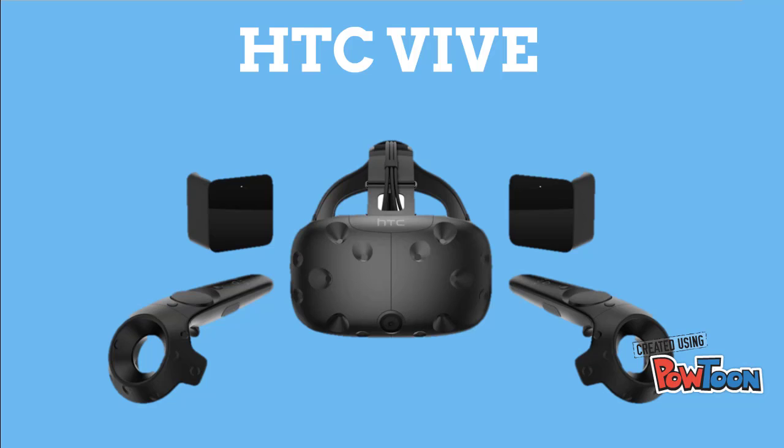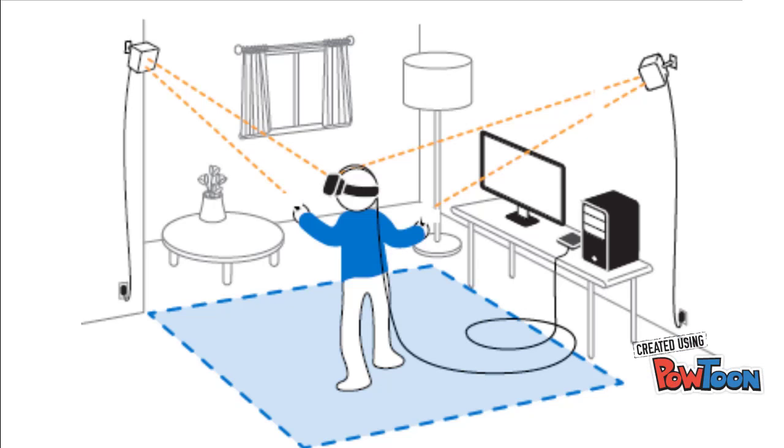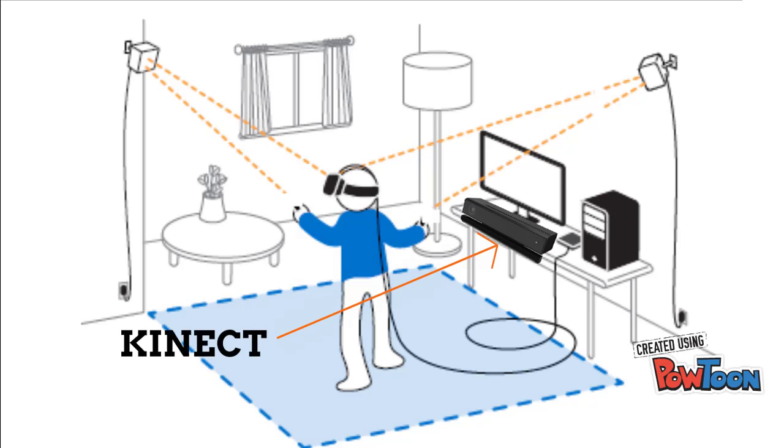especially with its controllers. However, in this system, we will use HTC without controllers, which are hard for the CP patient to carry, as we will use the Kinect sensor for detecting the motion of the patient's hand to be translated as a movement in the virtual world and initiate the virtual rehabilitation session.